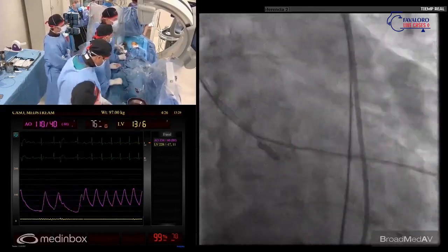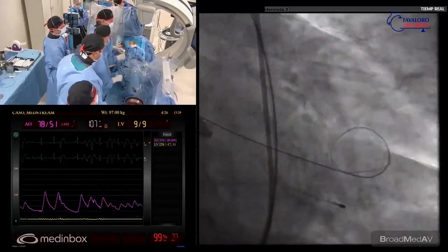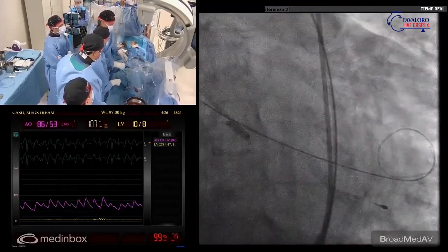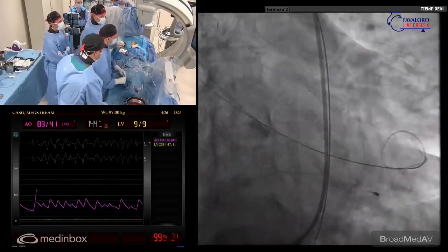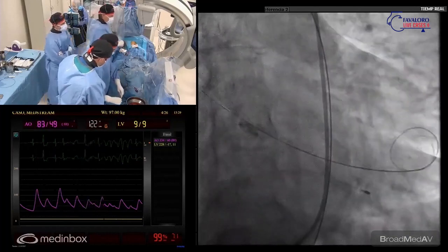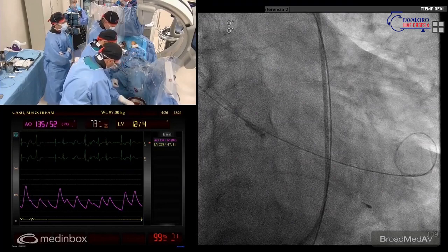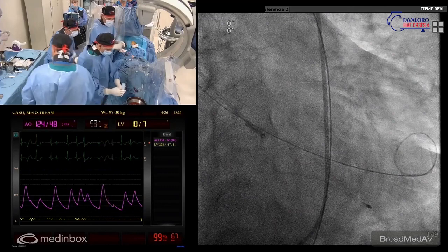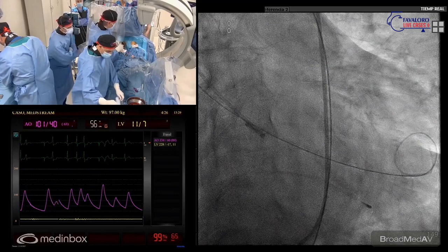Show me the tip. So there we inflate the balloon, and I don't remember what else. Show me so the tip can be seen. Okay, perfect. So now, leaving the wire in part of the intervention is very important, to very carefully and meticulously position the wire. It's a Confida wire, is that correct? Yes, it's a Confida. I showed it in the last case, but I am trying to take advantage of having you here and asking questions about your technique.